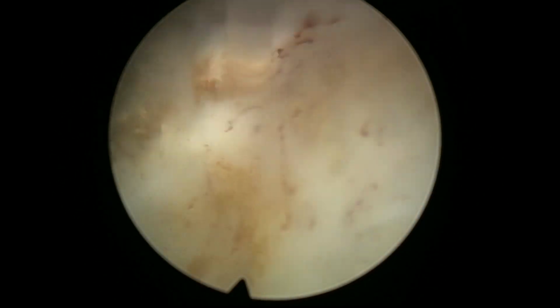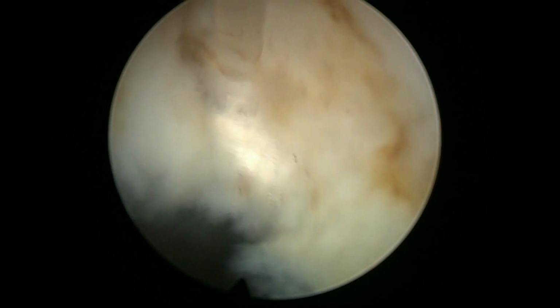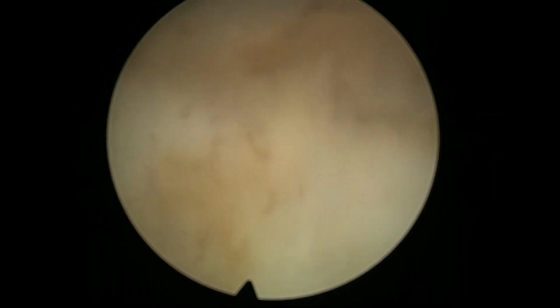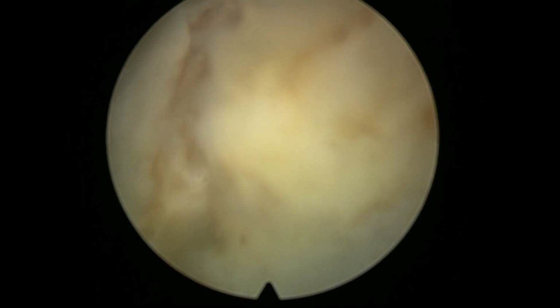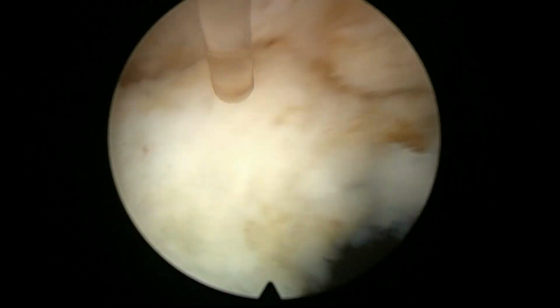Of course, we are doing a palliative surgery, and removing such a large amount of tissue. Patients should do well, but it's better also. There's a responsibility for us when we treat these patients to try to make sure that they don't need to return to the operating room in the future. If the catheter is taken out and they have a cancer that is going to compromise their lives in the future, of course, you would like to alleviate the situation so that they don't have to return again. So that was the motivation to remove this little piece.